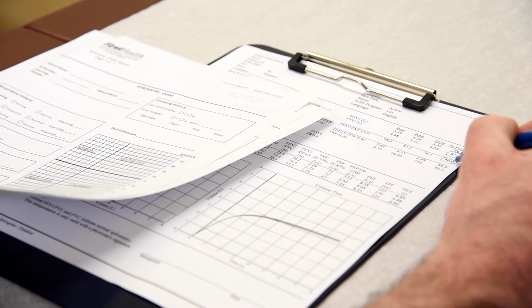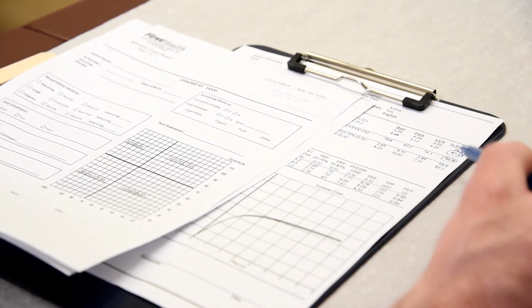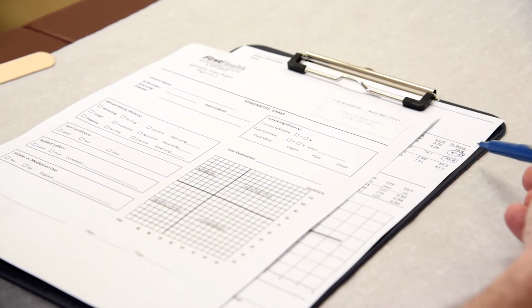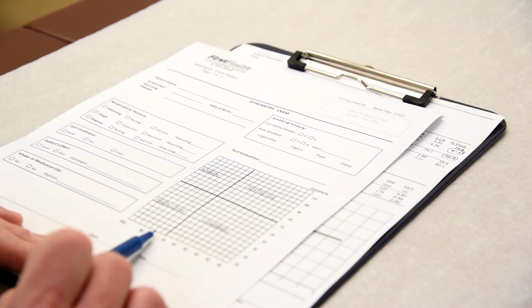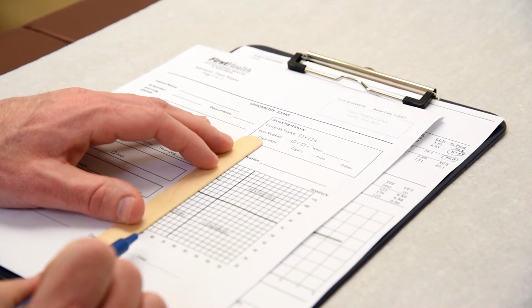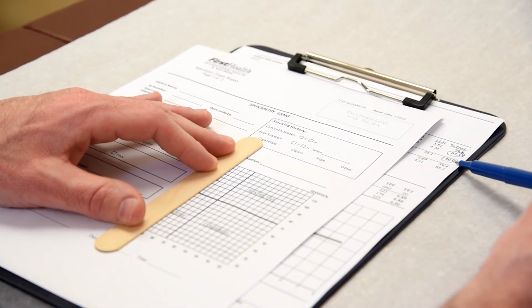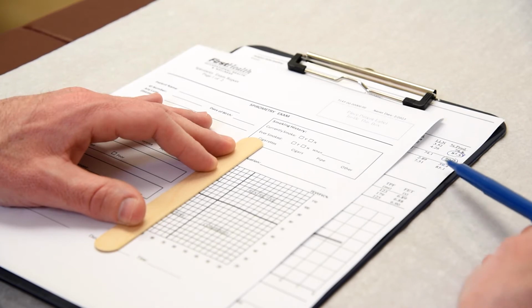This is what the employee produced. Of what they were predicted to do, this is what they did. So we will take those numbers. So first, the FVC. We find our FVC and we come over to about 87.5, so we're close to 90. And this is where I will use my ruler to place it up that chart just like that, about where I want it. And then my next number, which is going to be 90.9, again, that was the FEV1/FVC, and we see those numbers go up the side, and it's 90.